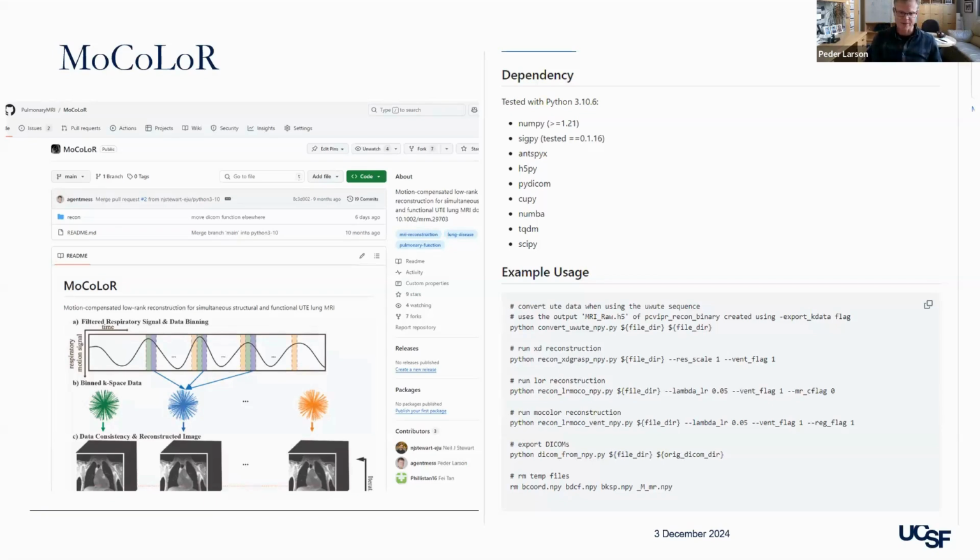If you're not familiar, check that one out for MRI reconstruction. ANTs, popular image registration that we used a lot. And again, it's not as big as some of these other ones like NumPy, PyDicom, these really big projects. And so keeping good track of these and making that accessible to your other users is really, I think, important in the lessons learned by this point.